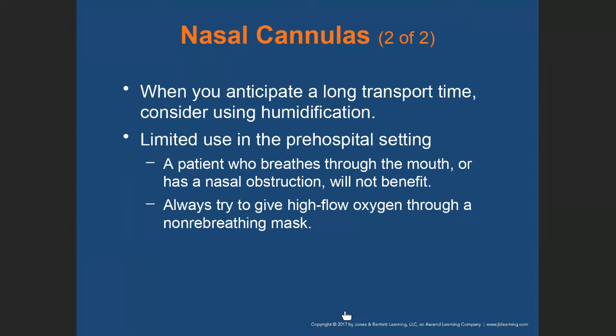And humidified oxygen means, when you look at the cylinder, for persons who are not aware, there is a canister attached to it with water inside of it that the oxygen goes into and then goes into the oxygen tubing. So it enters the canister first, becomes humidified, and then goes into the oxygen tubing to the patient. And we're famous for keeping that canister on the device, which is not supposed to be like that.